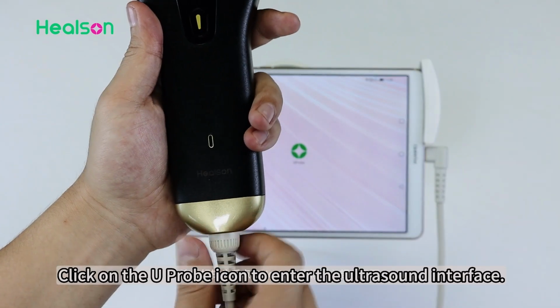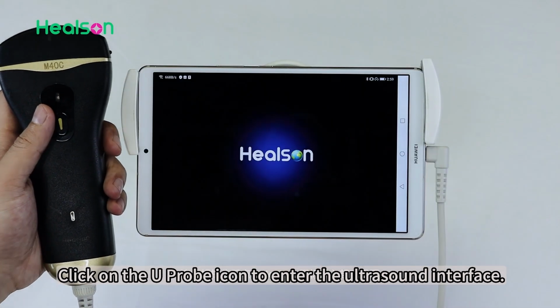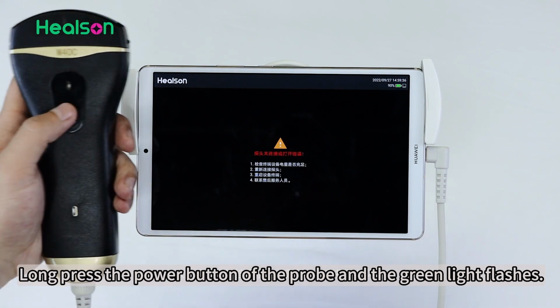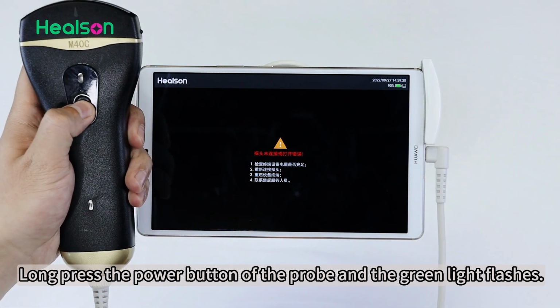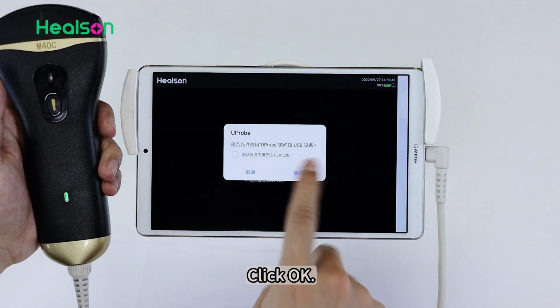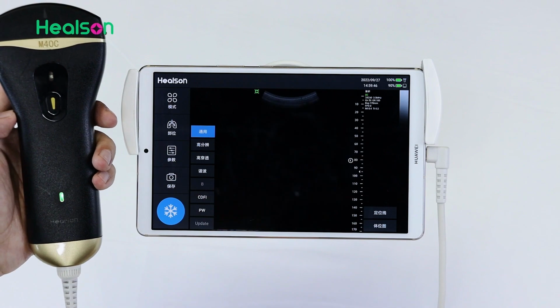Click on the U-probe icon to enter the ultrasound interface. Click OK. Long press the power button of the probe and the green light flashes. Click OK. This is the operation and display interface.